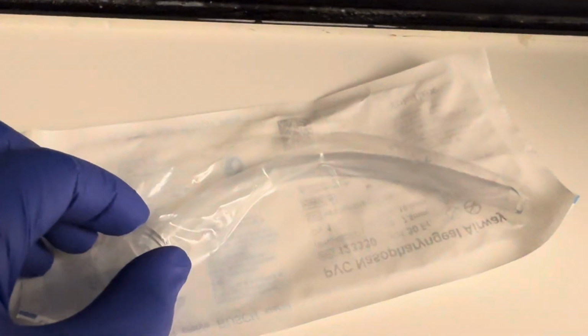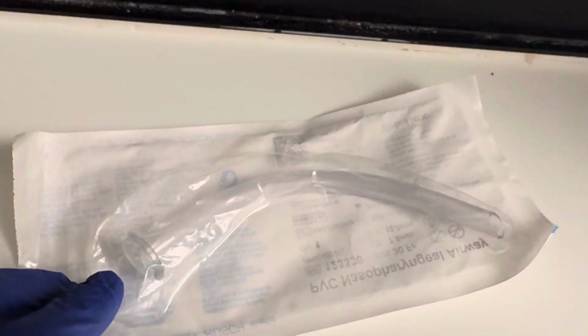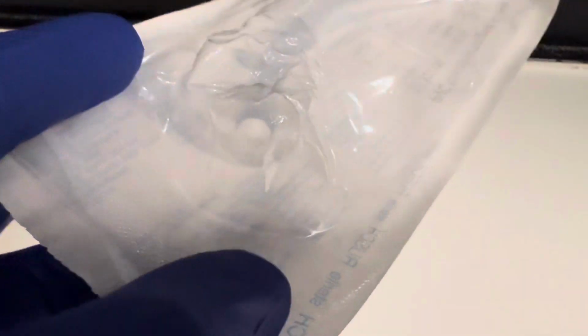This is what we call a nasal trumpet, a nasopharyngeal airway. We usually measure it from the tip of the patient's earlobe to the tip of the nose, to make sure it's the correct patient size. You see the opening.